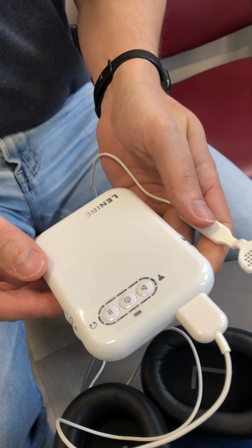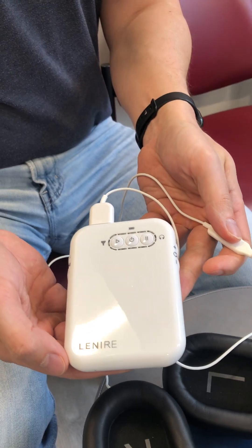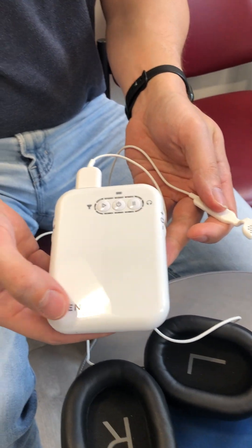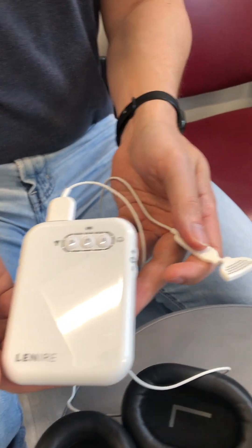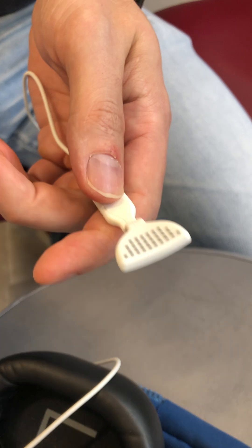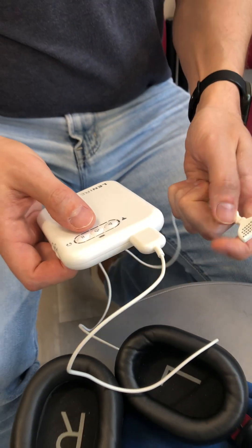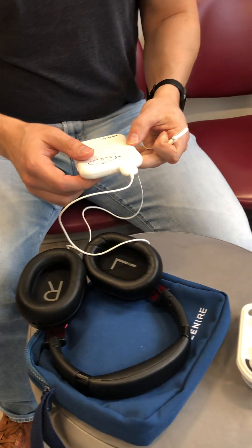There's the device, and that's what makes the sounds and sends signals to the headphones. And this — those are little electrodes, right? They go on the tongue. Okay, so how does it all work? And then you have a set of headphones there?